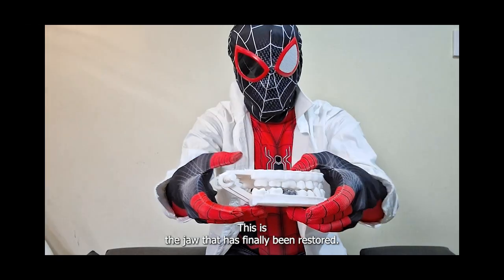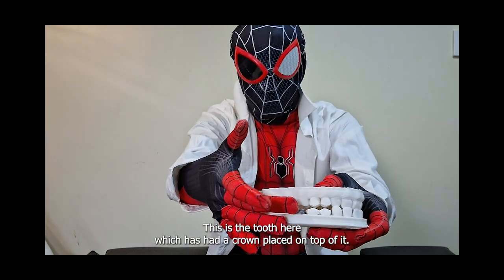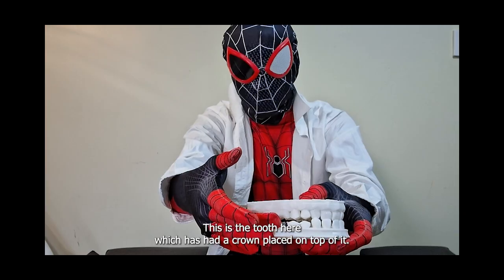This is the jaw that has finally been restored. This is the tooth here, which has had a crown placed on top of it.